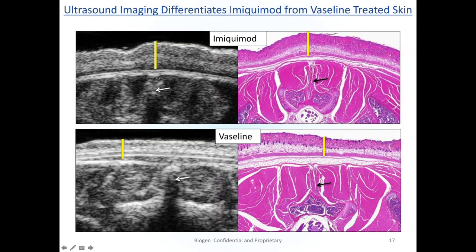We did a number of different things. We started from the spinal cord. We did do a lot of caliper measurements. We would have our ultrasound image and make sure they were both scaled exactly the same, so we knew that our microscope images were measuring the same millimeters as the ultrasound images. Then we applied the shrinkage factor that you would expect from the paraffin fixation and so on.